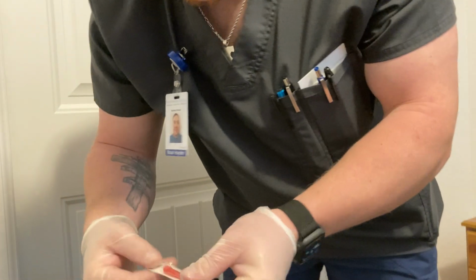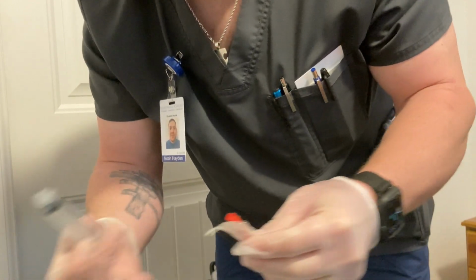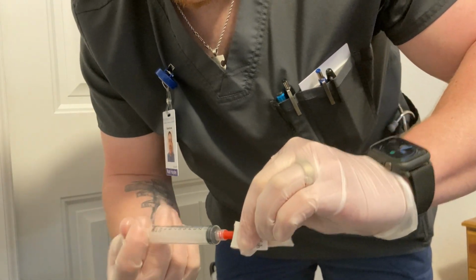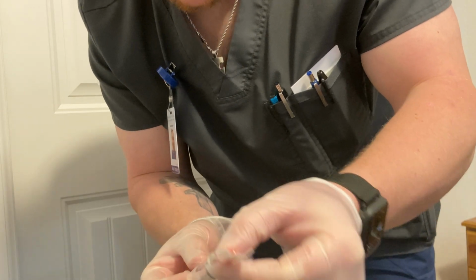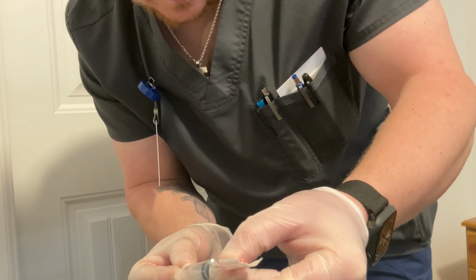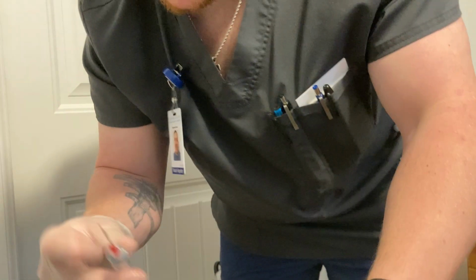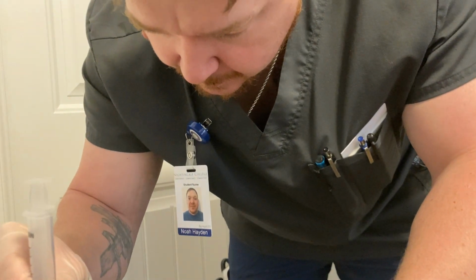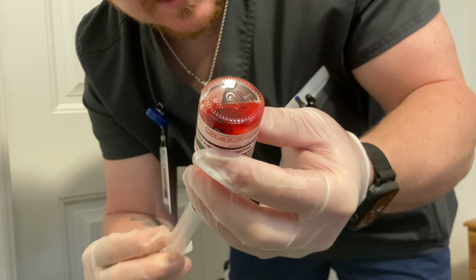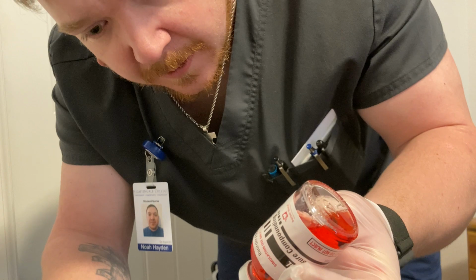I will open my fill needle, making sure to use aseptic technique. I will put my fill needle in. I'm going to withdraw 1 mL of air into my syringe. Okay. I'm going to place this into my heparin vial. I'm going to invert and inject 1 mL of air into my vial. I'm going to withdraw 1 mL of heparin solution.